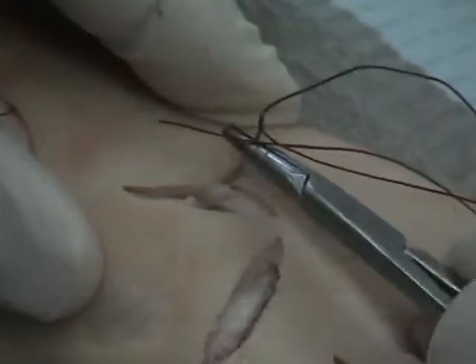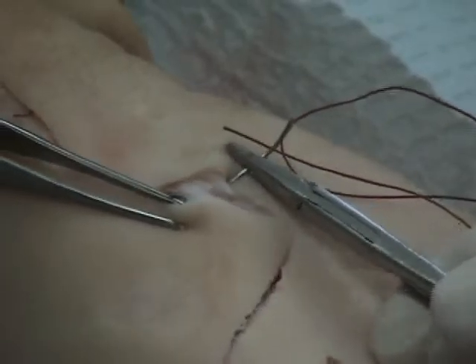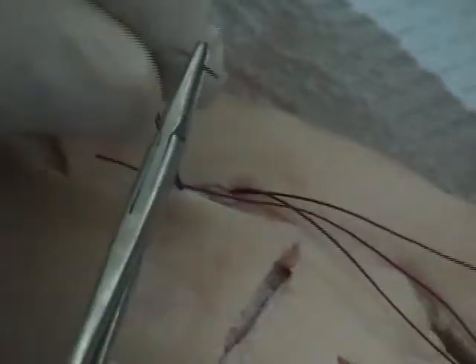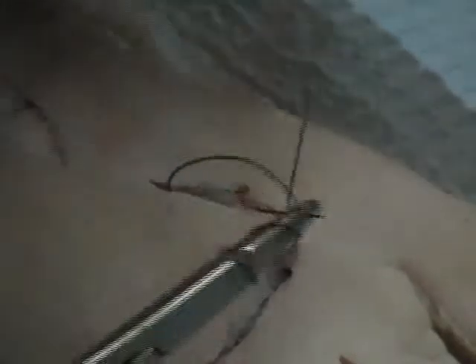Try again here. Pull the skin back, pull the needle through. My needle disappeared — there it is. Pull it through. And I'm under the dermis, so I'm actually down in subcutaneous tissue under the dermis, and I'm just going to tie this off like I normally would a standard simple interrupted.